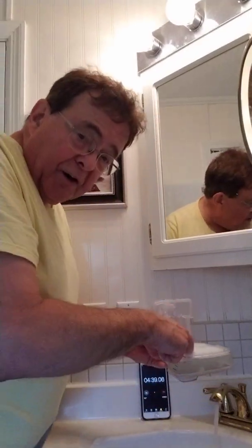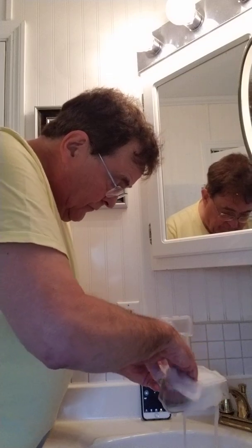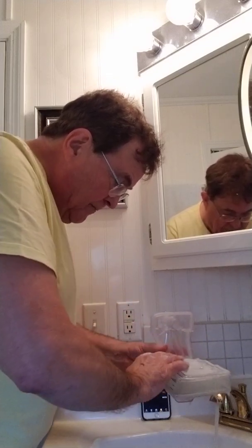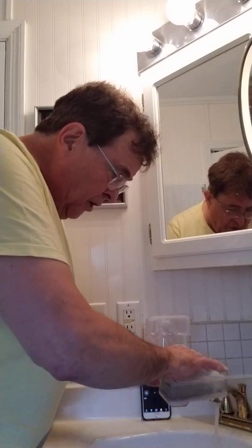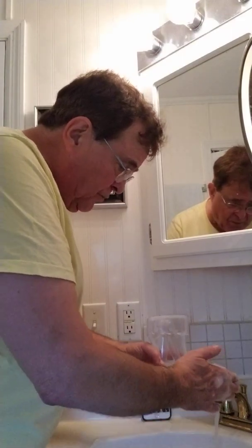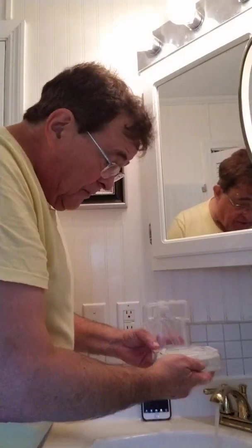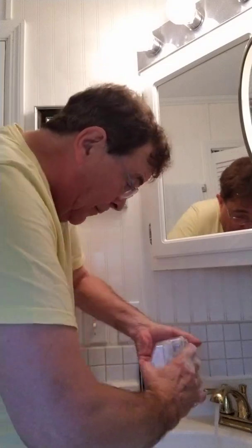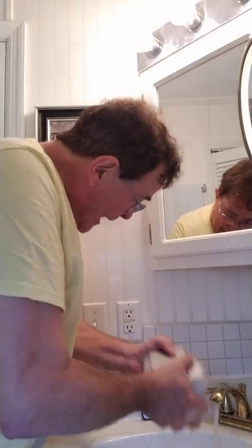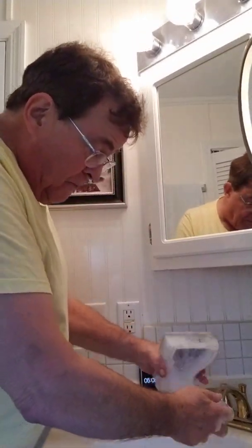Now, you go with your finger down along underneath the ridges, and just reach the sides and the bottom a bit, and the top. And I'm going to tell you something. I've run one of these tanks for about 1 year without any trouble. Now that I've done that, I'm going to close it up, upside down, and start shaking the daylights out of it. Yes, sirree. Now, I'll turn it up, open it upside down.